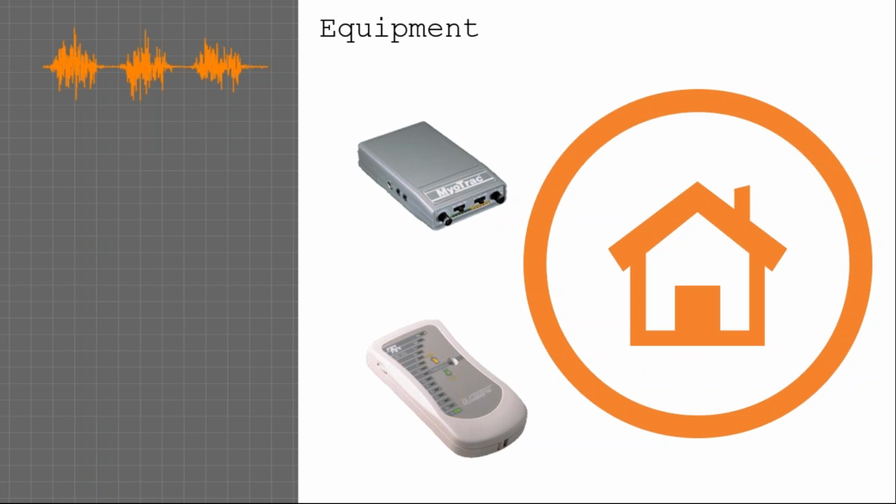So if you're seeing a client once a week, you can send them home with this unit and have them do another couple sessions, so they have 3 training sessions within a week instead of 1, and the recovery and their muscle function is going to be recovered to a normal level much quicker.